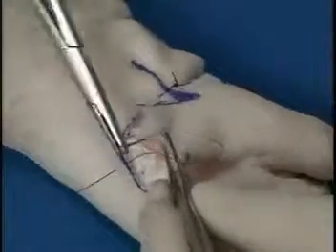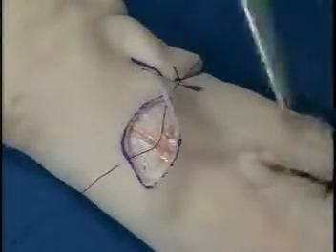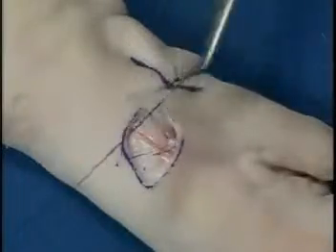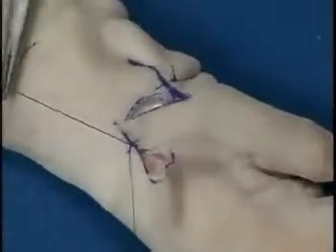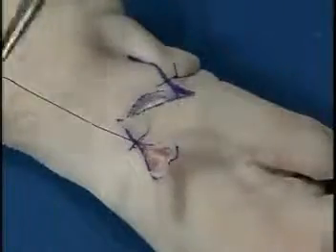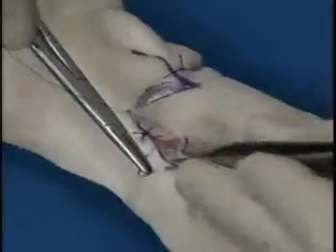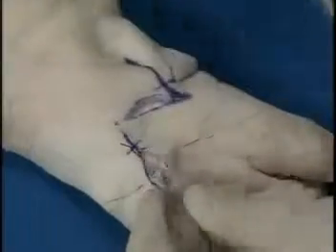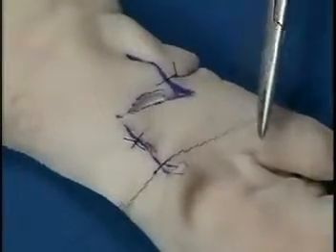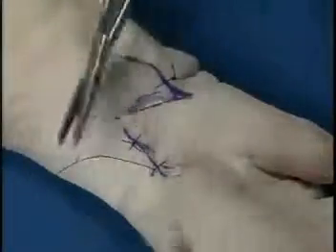Notice this is a triangle being rotated into a circular defect. So we need to be able to trim the excess of that flap so it fits and will inset nicely into the circular defect. Here we see the dog ear. So we place a suture to close this end of the flap. Placing it in position, we can see the dog ear has now been created. We will remove that by making the back cut and then sewing that into position.